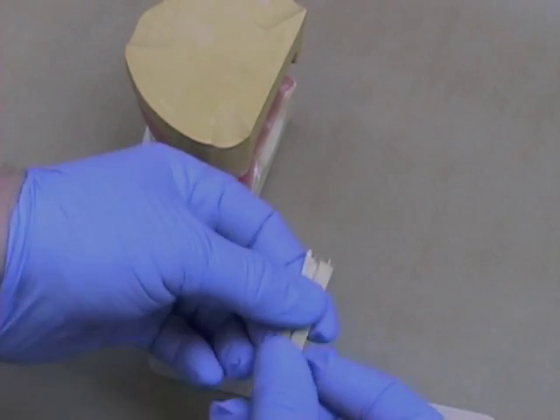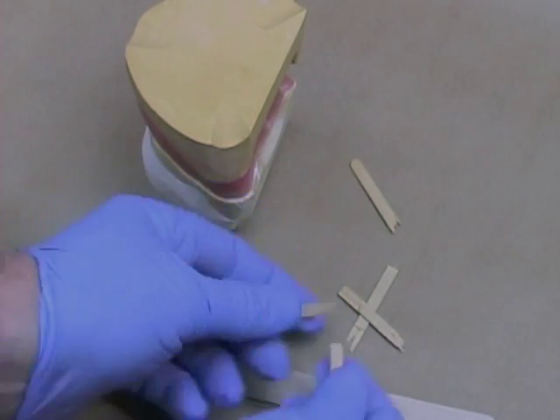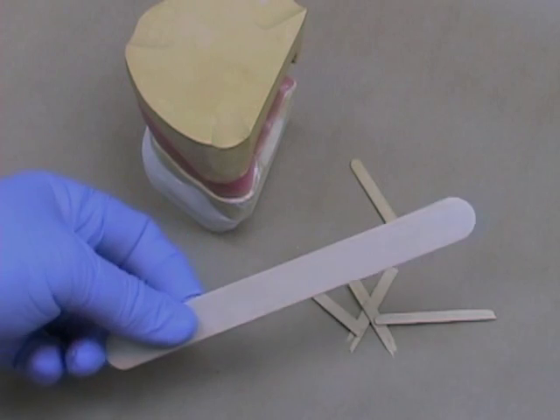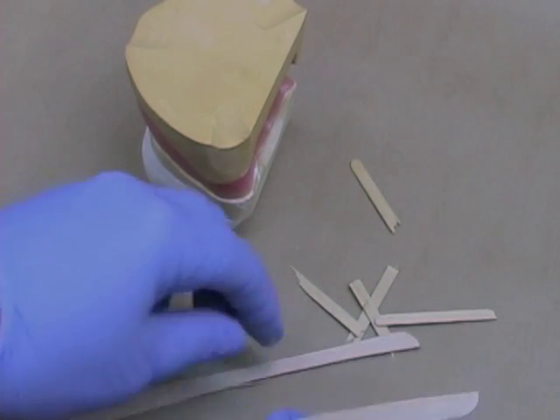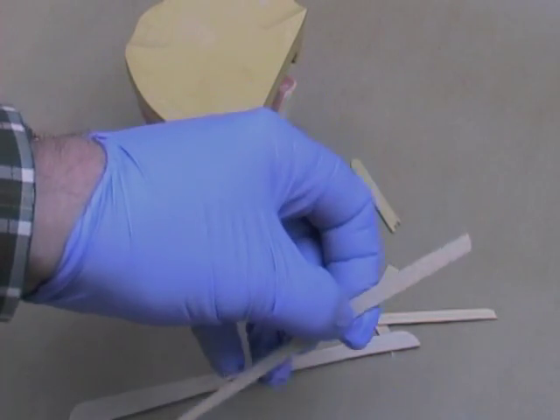Break up wooden coffee stir sticks or tongue depressors into small pieces. These will be used to stabilize the mandibular cast to the maxillary cast so it won't move during mounting. Mounting error can be as much as 1.5mm if you don't immobilize your cast.